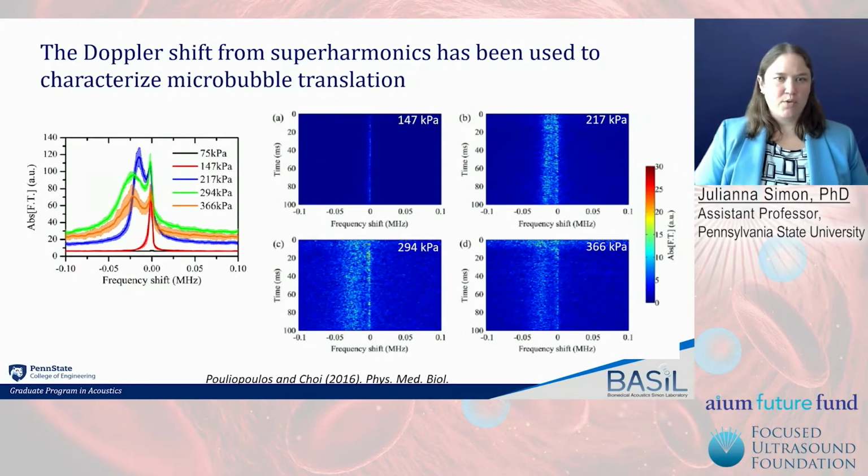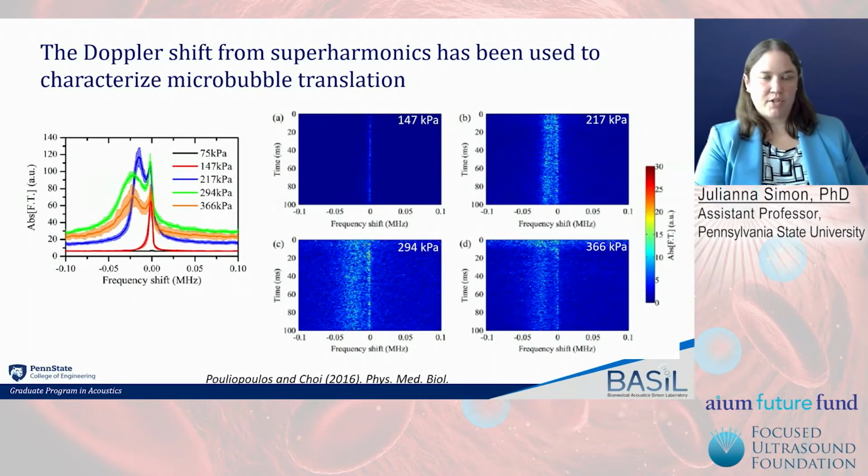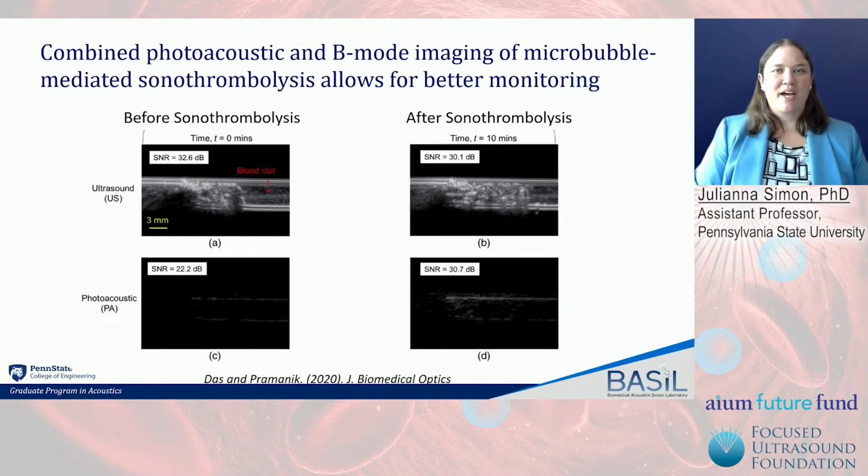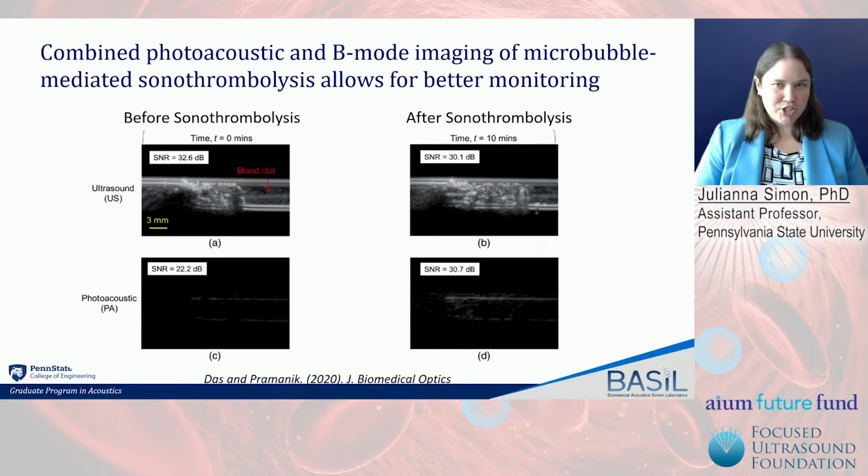But I thought this was a pretty cool paper that's using Doppler to look at how the bubbles are moving. Others are using combined photoacoustics and B-mode imaging for microbubble-mediated sonothrombolysis because it allows for better monitoring. In sonothrombolysis, when you get those microbubbles in, it can basically occlude your field of view, and so we don't know how well the clot's broken up.